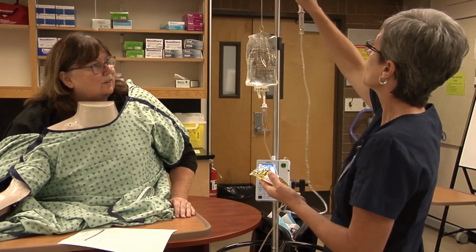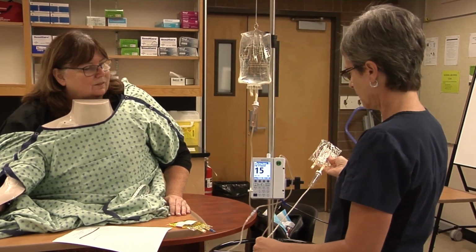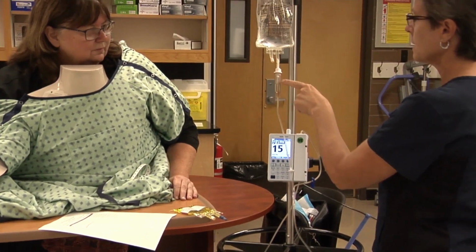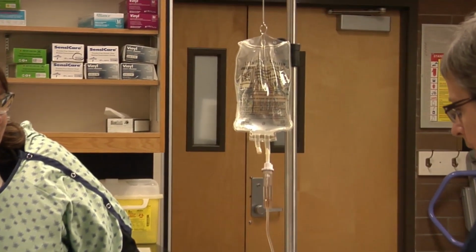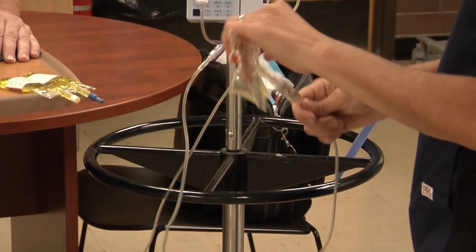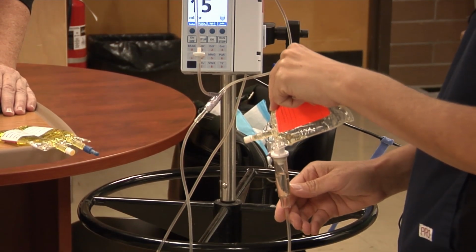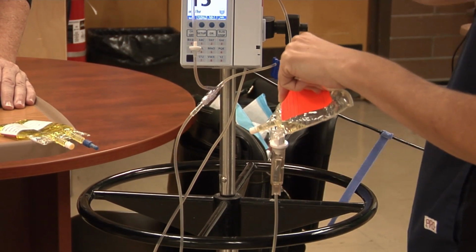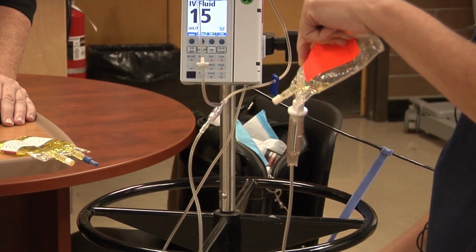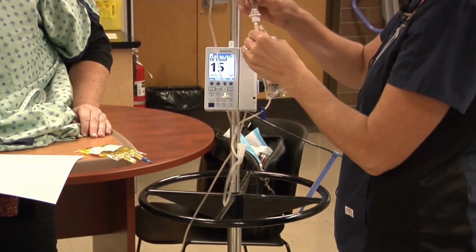So it's not. I could go ahead and get a whole brand new secondary line, but I'm not going to. I'm simply going to backflush. And what you can see happening is this primary bag is draining. It's following the path of least resistance, and it's flushing right into that, filling that up. So you have to think about gravity. It has to be below or it's not going to fill. We're going to at least fill the drip chamber, and then I'm going to shut this off, and then I'm going to empty the drip chamber.